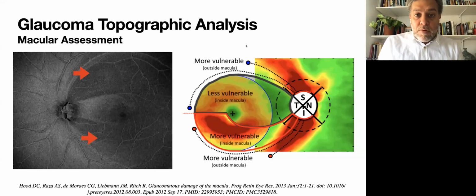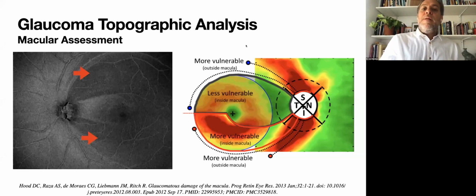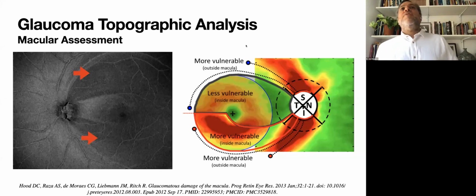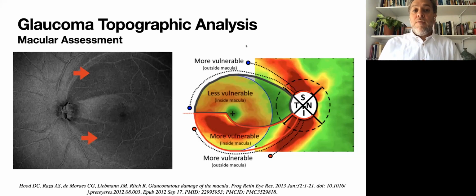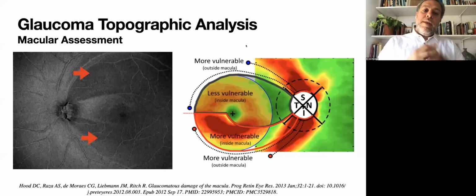Which test is more reliable for glaucoma, visual field test or OCT findings? Oh, okay. So there is pre-perimetric glaucoma, where you won't see any defect on the visual field. There you could see defects on the OCT. If it's more advanced glaucoma, we do prefer to follow up patients with visual field testing instead of OCT, due to the floor effect. When the RNFL reaches a level that is so low, we couldn't use that to follow up patients. We could use the macula.